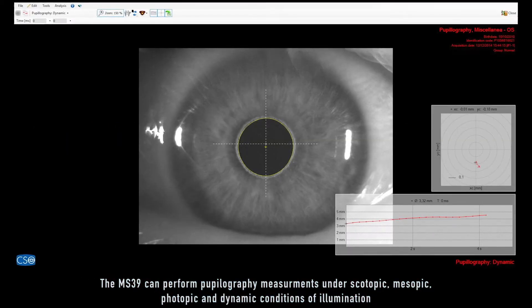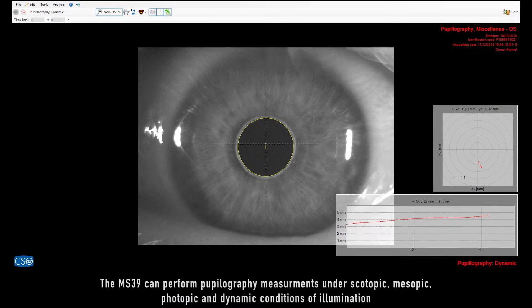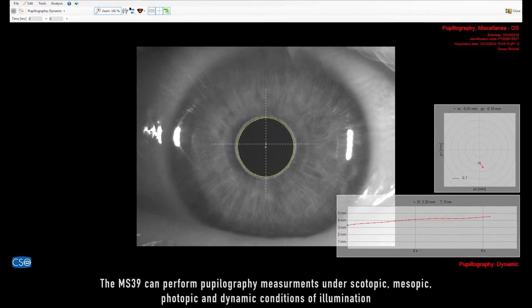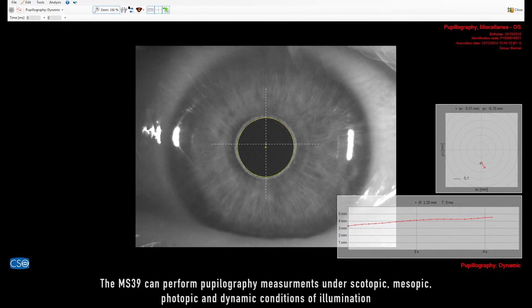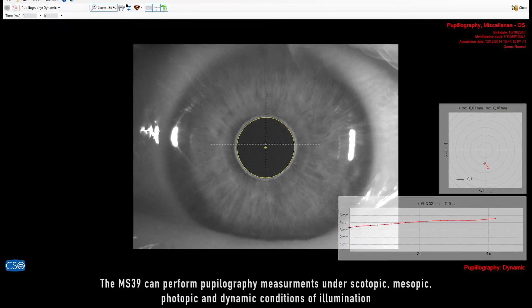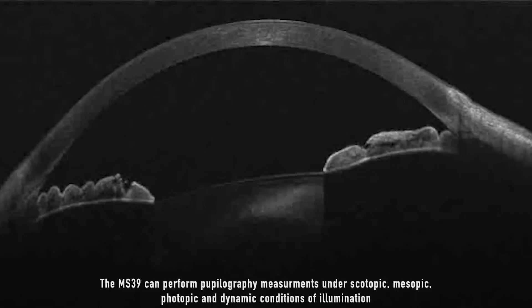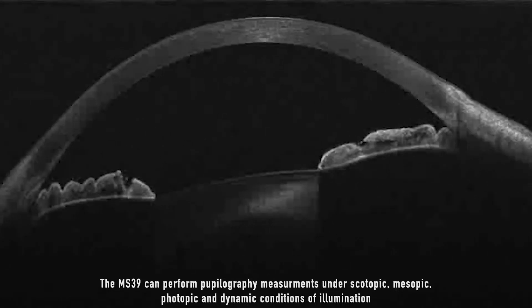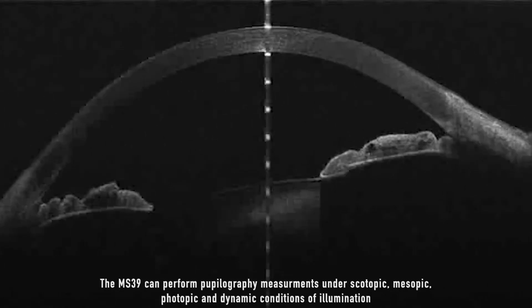MS-39 can perform pupilography measurements under scotopic, mesopic, photopic, and dynamic conditions of illumination.